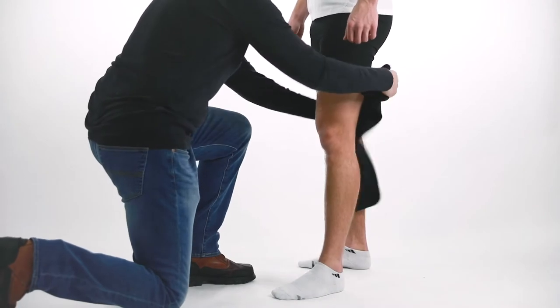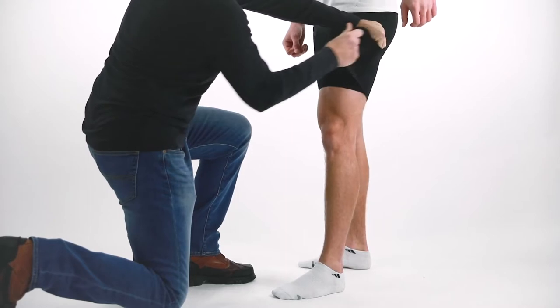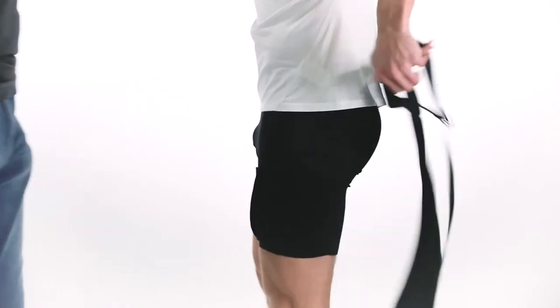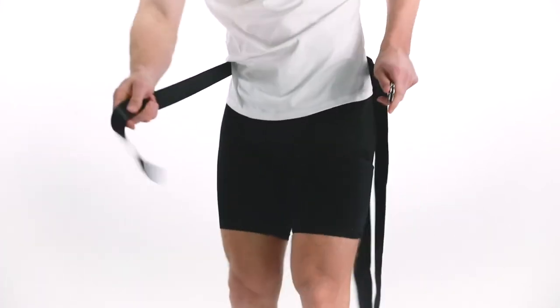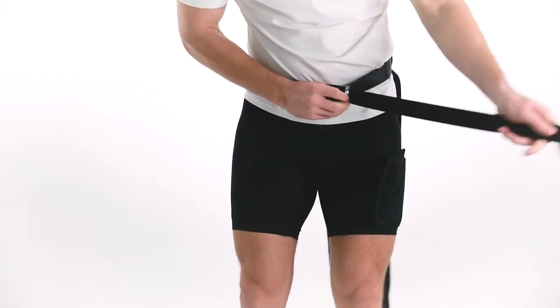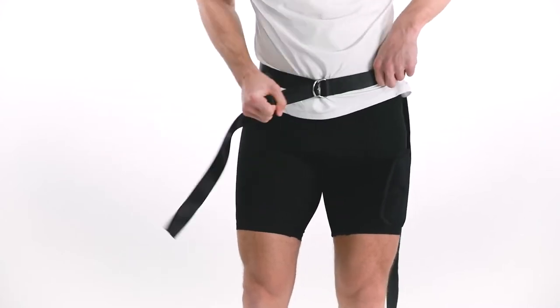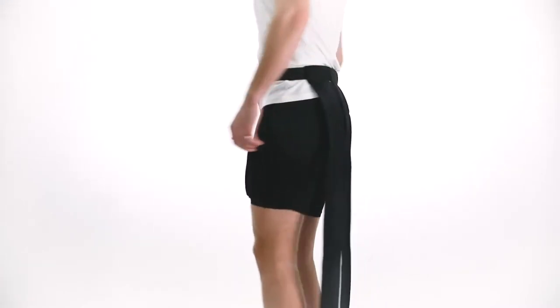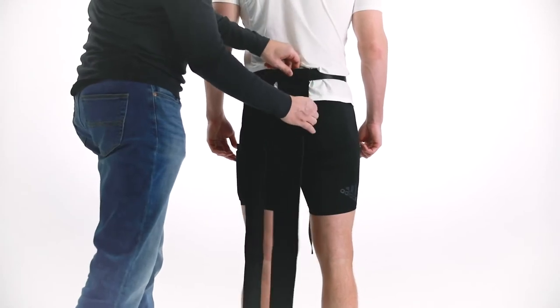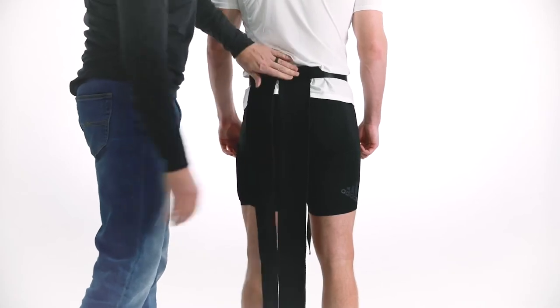Secure the thigh wrap around the upper leg to provide compression to the affected hamstring, or wear compression shorts in place of the thigh wrap. Secure the nylon belt with the attached straps around the waist using the D-rings and tighten until snug. Allow the two straps to dangle down to the floor, positioning strap A between the buttocks and strap B two to three inches laterally toward the affected leg.